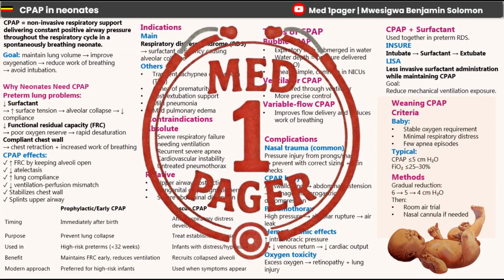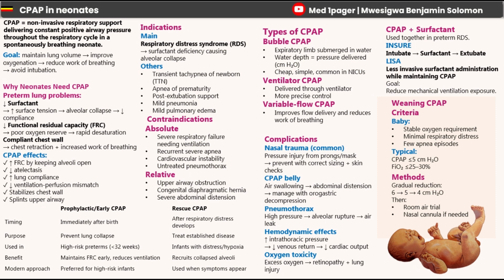One of the most prescribed drugs in the neonatal intensive care unit, or the NICU, is going to be oxygen. And there are very many modalities by which we can administer this oxygen. One of the most important when it comes to neonatology is CPAP, or what we call Continuous Positive Airway Pressure. Now, in this video, we're going to look at CPAP in detail and cover all the theoretical aspects that are very, very important that you have to understand.